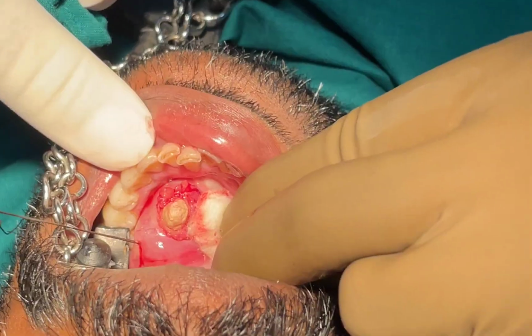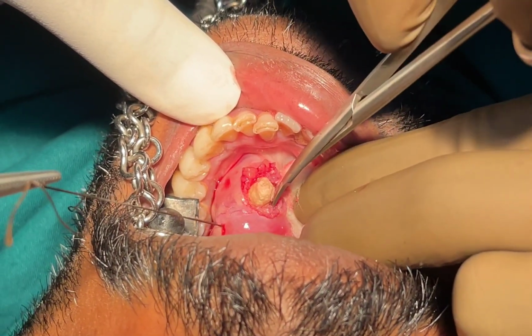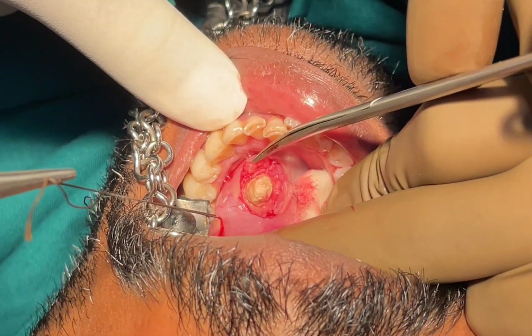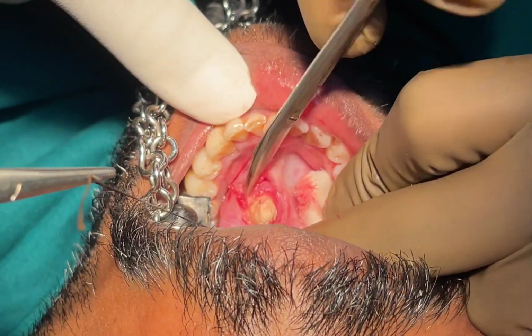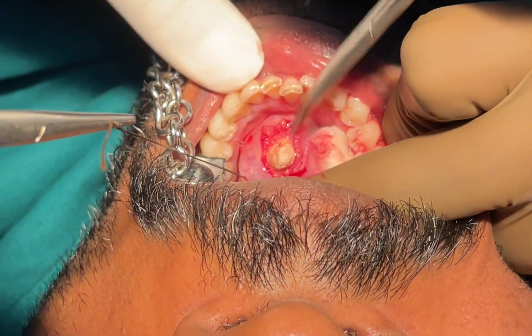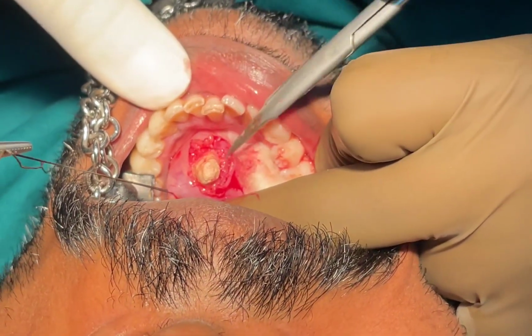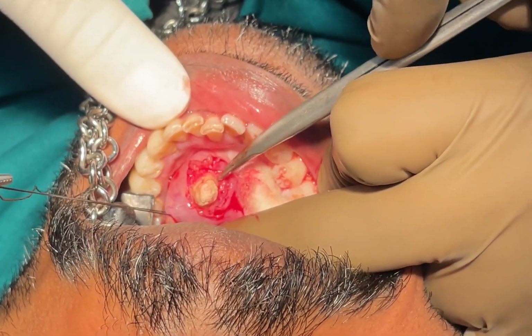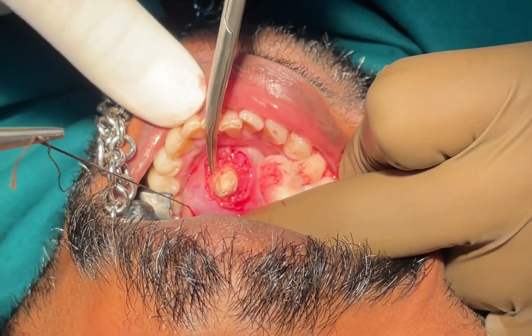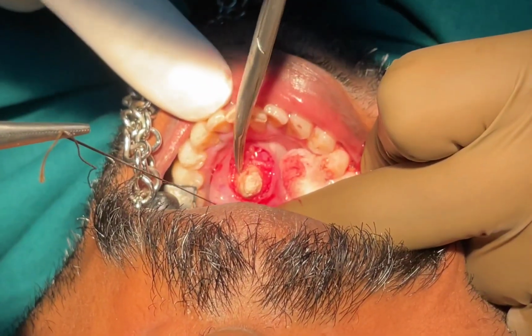So it is very vital to get a proper plane between the stone and the soft tissue, and especially try to get access to the posterior aspect of the salivary calculus. By getting access to the posterior part of the calculus, you will be able to relieve all the tissue adhesions. At the same time, you will be able to push the stone from the posterior aspect anteriorly. So that is what we are trying to do right now.